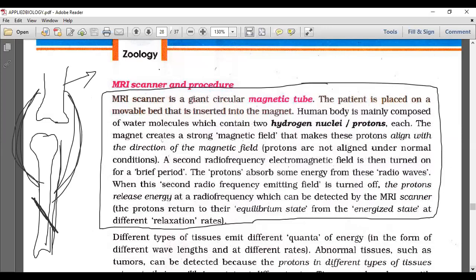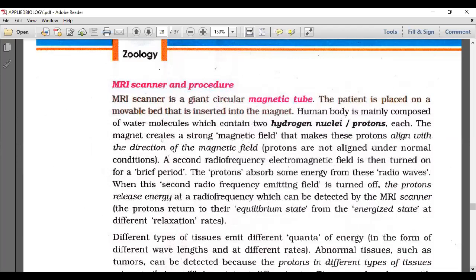So we know the normal condition. That's why we are able to recognize this kind of abnormality. Got my point here? Some fragments or pieces are observed here. In normal condition, we don't find those pieces, isn't it? So that means some breakdown has happened that we can recognize. So in such cases, you should know what is exactly normal. I'll give an example here, not necessarily for MRI scanning, but as an example.